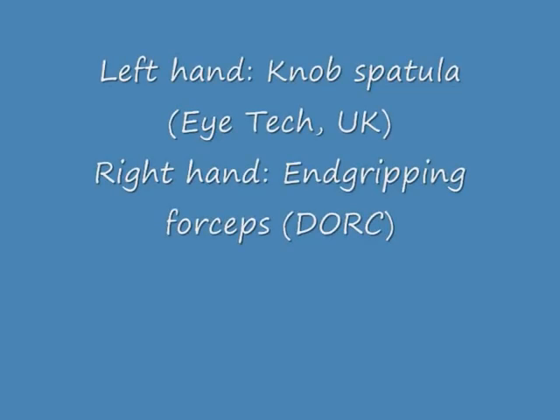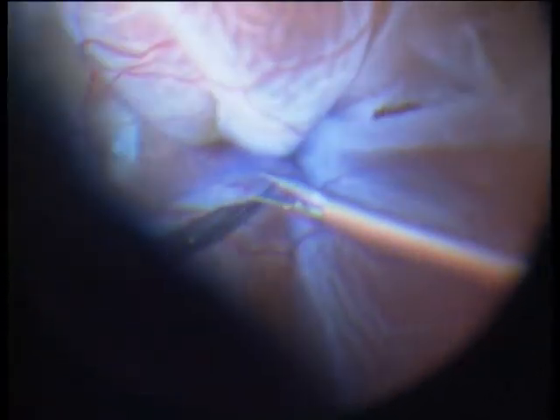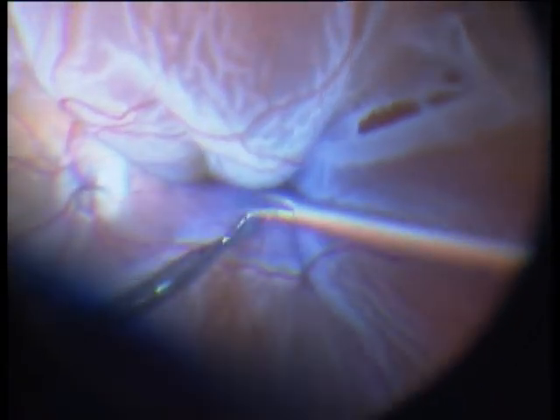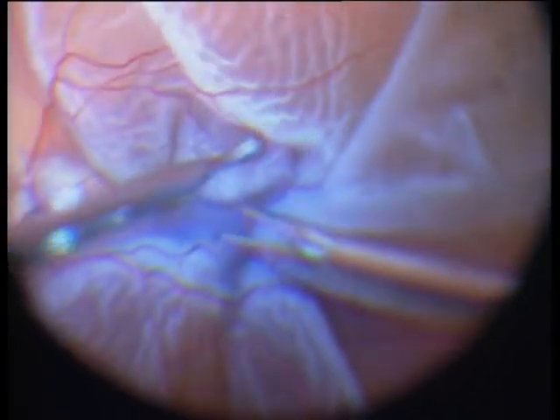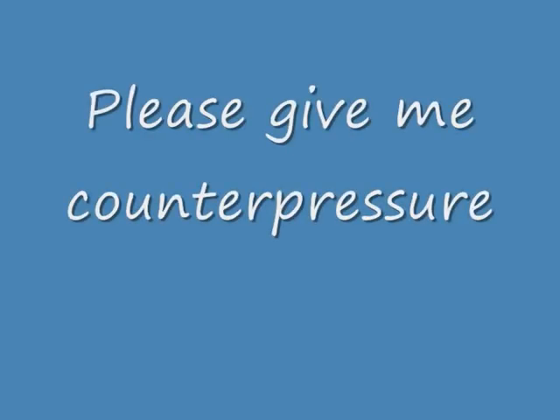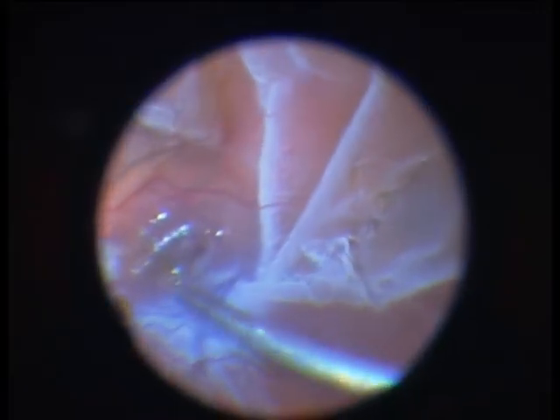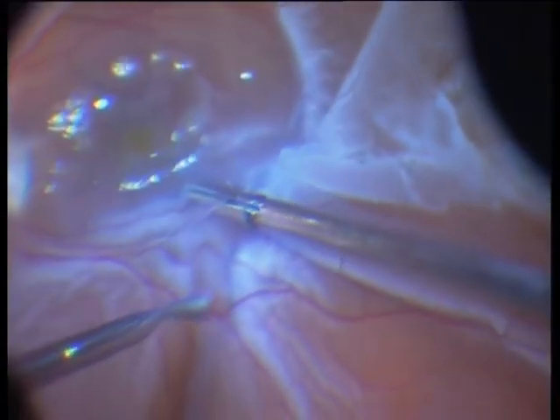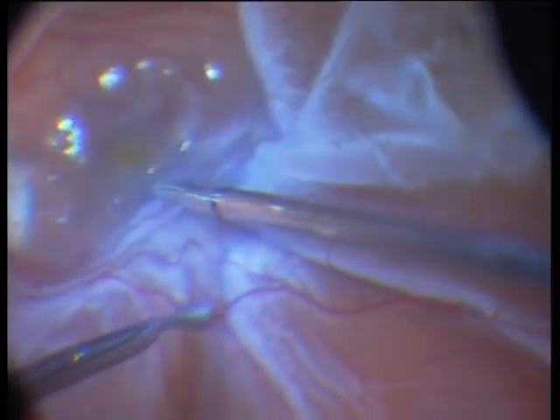In the left hand I have a Knopf spatula and in the right hand I have an end-gripping forceps. I am trying to grip this membrane, and of course the difficult problem here is that the retina is detached. I need counter pressure, and that is why I inject a small perfluorocarbon bubble — here you see it. Now I go under this bubble and try to grab the membrane.